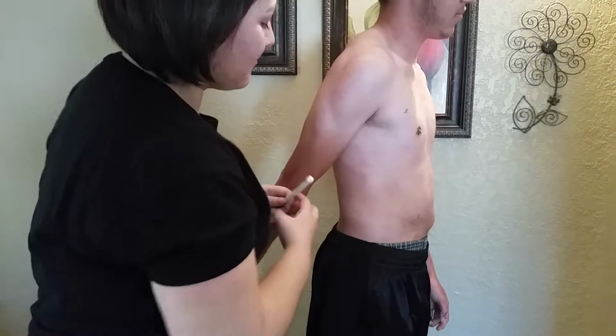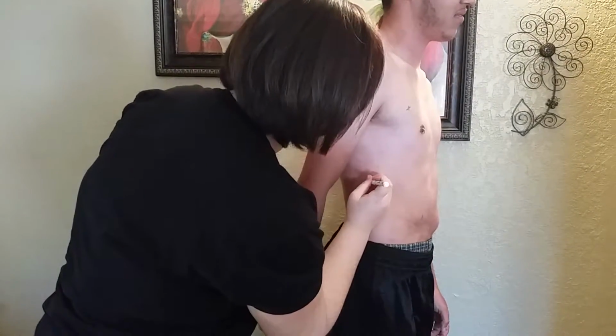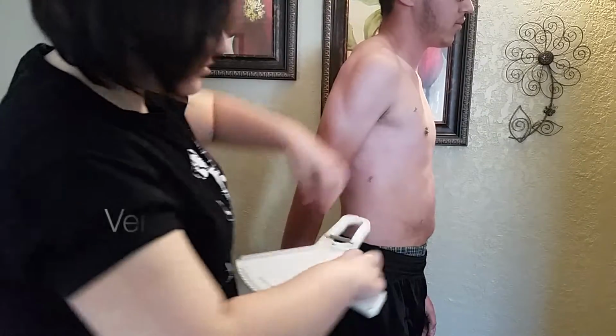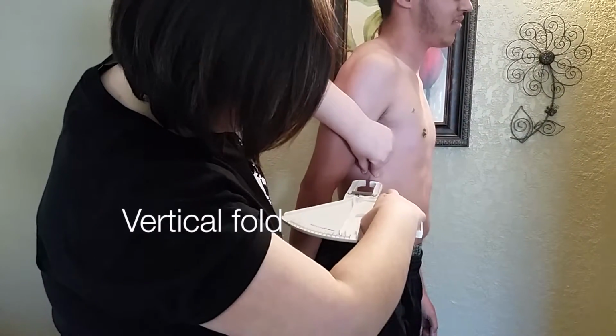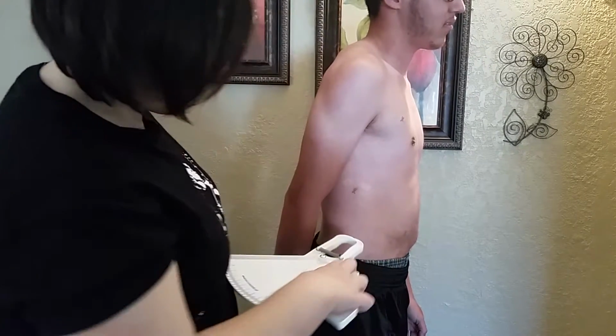For the mid-axillary site, have your client move their arm back. Mark your X on the mid-axillary line at the level of the xiphoid process of the sternum. Obtain a vertical fold, hold on for 1 to 2 seconds, and release.